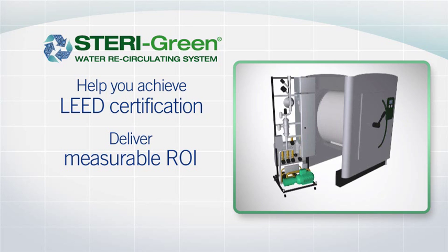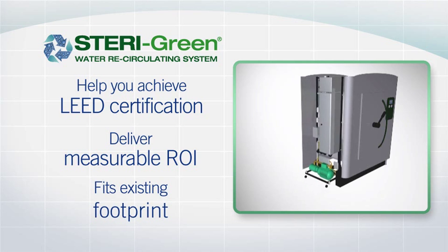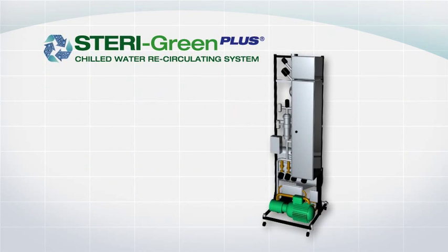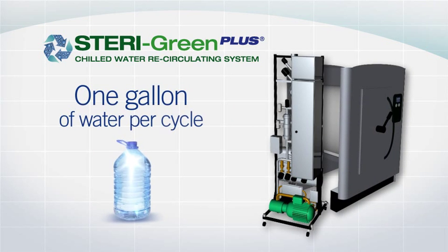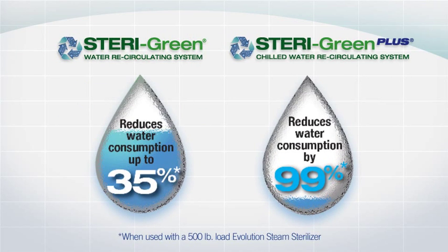And best of all, it fits within the existing footprint of the Steris Evolution Steam Sterilizer. Steragreen Plus, when used with the Evolution Steam Sterilizer, uses just one gallon of water per cycle. Add the Steragreen or Steragreen Plus water recirculating systems at the time of purchase of an Evolution Steam Sterilizer, and you'll quickly see a return on your investment.